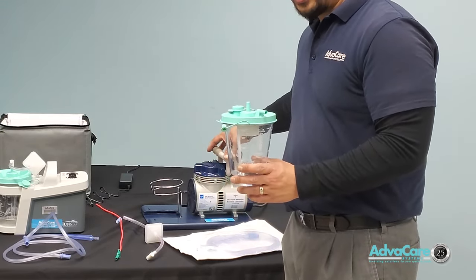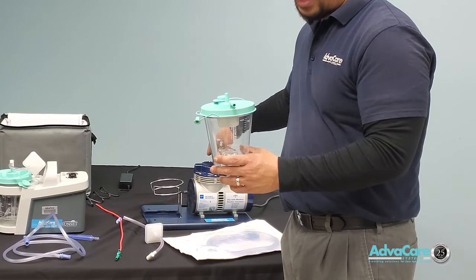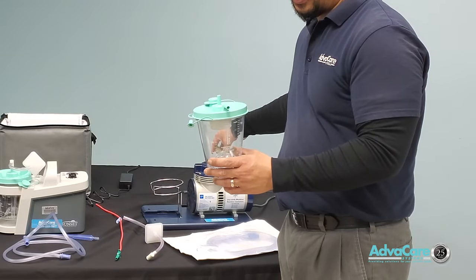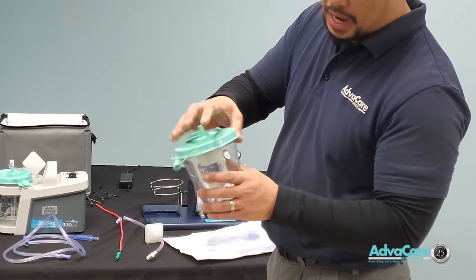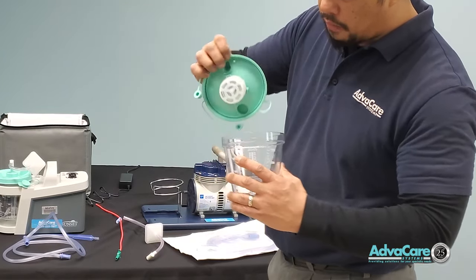Any type of air leaks will not allow the suction pressure to build properly and may not provide enough pressure to clear any type of blockage the patient is experiencing. This canister cap must be sealed completely.